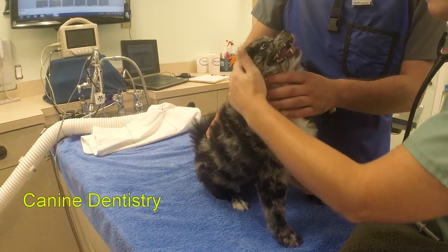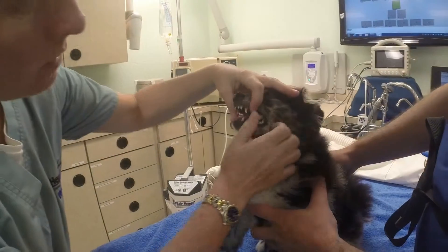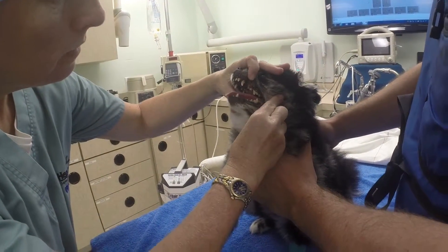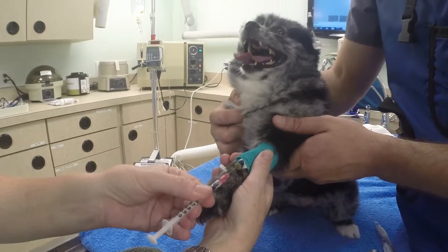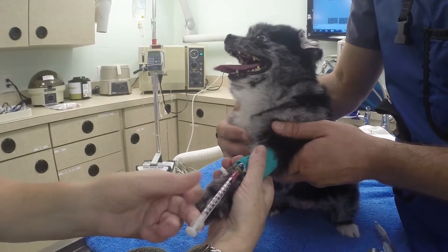All animals have pre-surgical blood work performed and a general physical exam focusing on the heart, lungs, and gum color prior to anesthesia. If all systems are go, a mild sedative is given. This sedative relaxes the animal and allows us to place a tube in their trachea called an endotracheal tube.